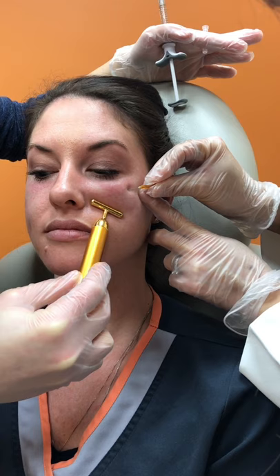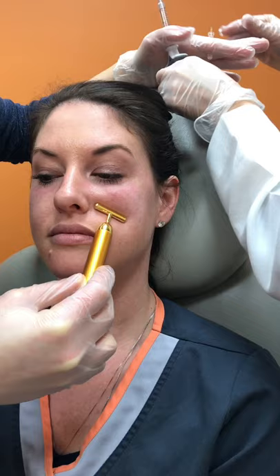Focus on your breath. Now you're going to feel some pressure.